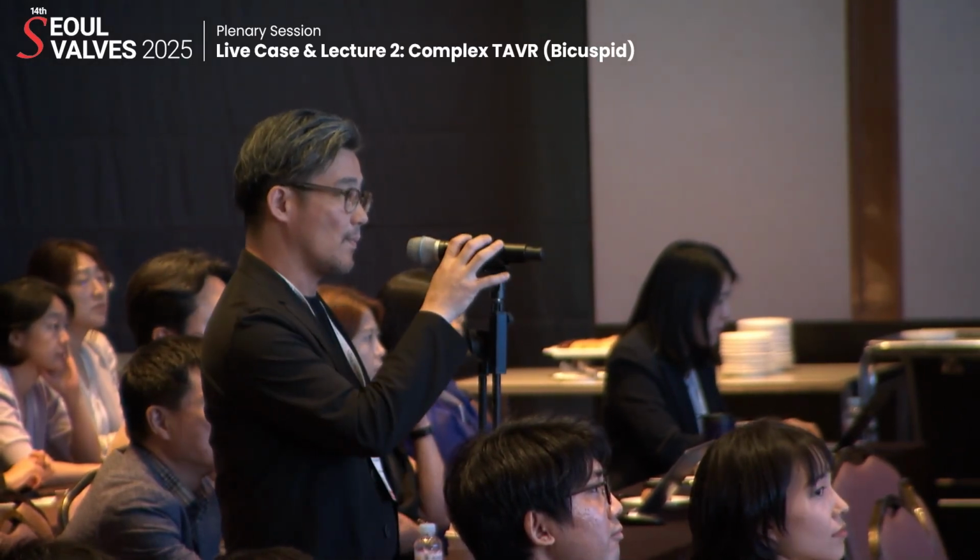I have one more question to Dr. Kentaro. I saw your case, so I know that it's very difficult to get the perfect circularity, especially in the bicuspid aortic valve patient. But I wonder in which situation do you use the post-balloon after TAVR in the bicuspid patient?